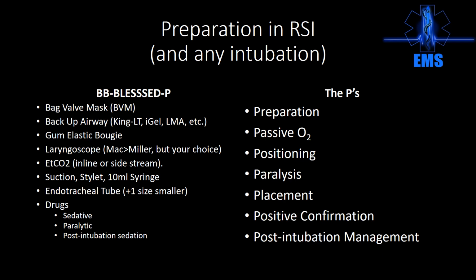You need misting and fogging in the tube. You need condensation in the tube. You need breath sounds present on both sides, or you need to make sure that you didn't go too deep and drop a right mainstem intubation. You need absence of breath sounds or absence of air over the epigastric area. And ideally, you should be able to have a recorded video laryngoscopy view showing that that tube successfully negotiated the cords.